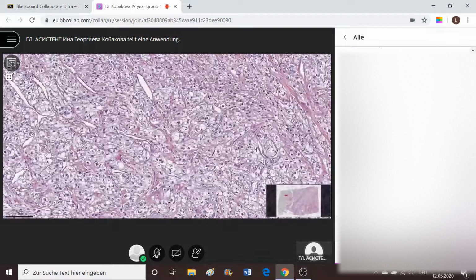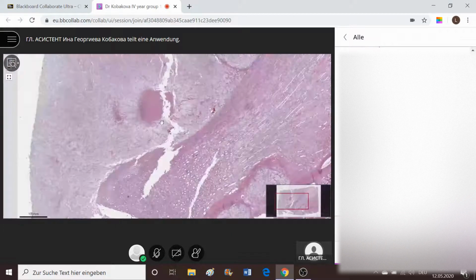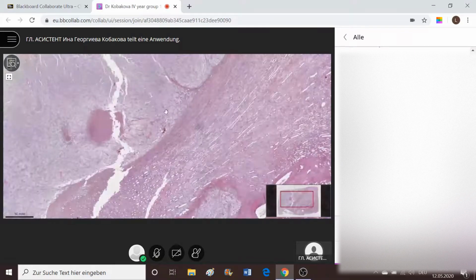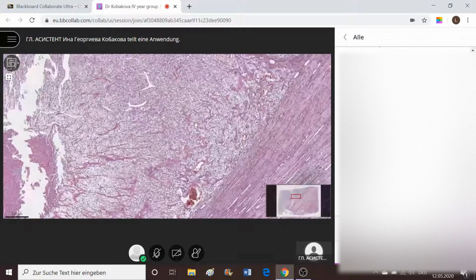What we should observe at this type of tumor is that, on the opposite of normal tumor understandings, where we should expect malignant tumors to be the darker field of the slide, this one is a lighter one. That's because these cells are rich in lipids and glycogen in the cytoplasm, which appears to be optically empty when it's fixed with alcohol.